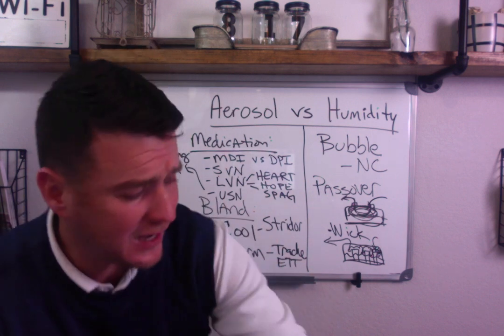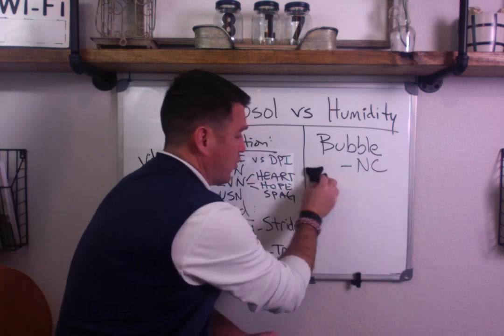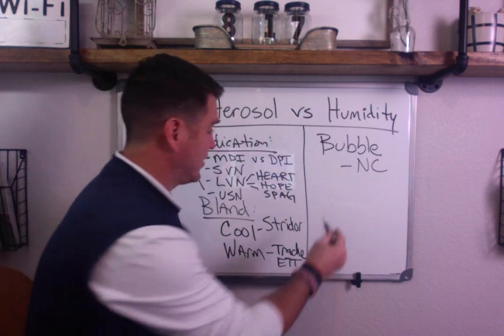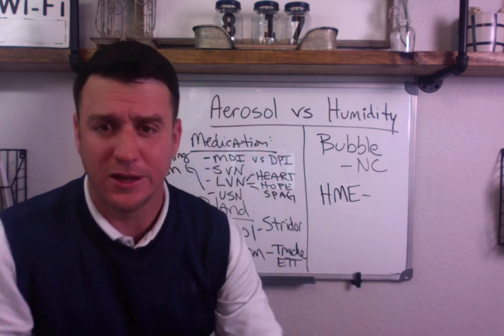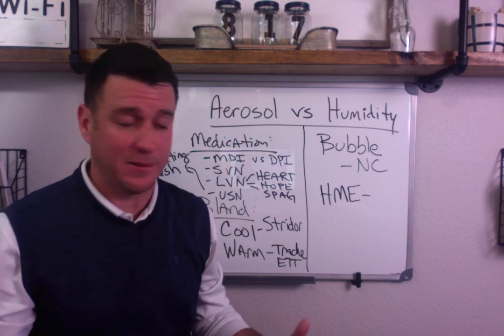Okay, the last thing we need to talk about here is, and again, there's more that we're not covering. I'm just kind of hitting the highlights here because this is already approaching 30 minutes. And if I hit any more than the highlights, I could take this probably on for an hour. You're talking about aerosol and humidity, which is 1 to 2 hours of lecture time in the classroom.